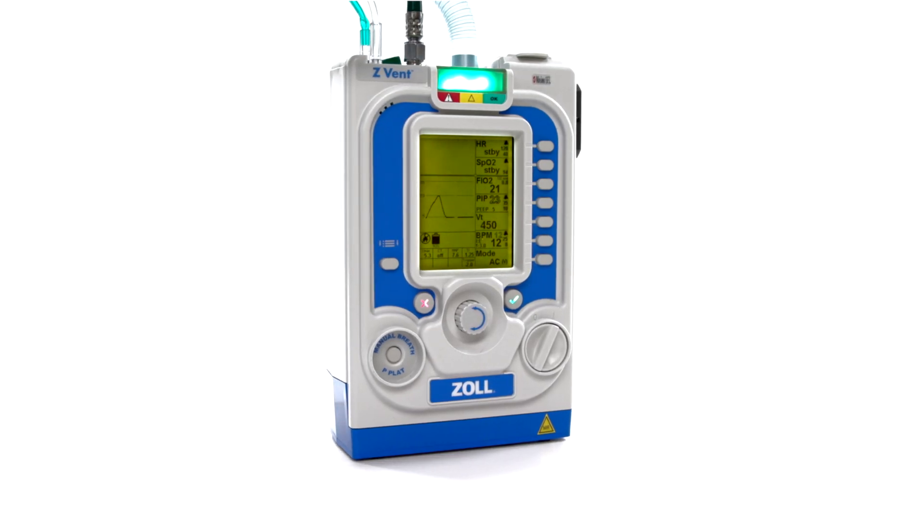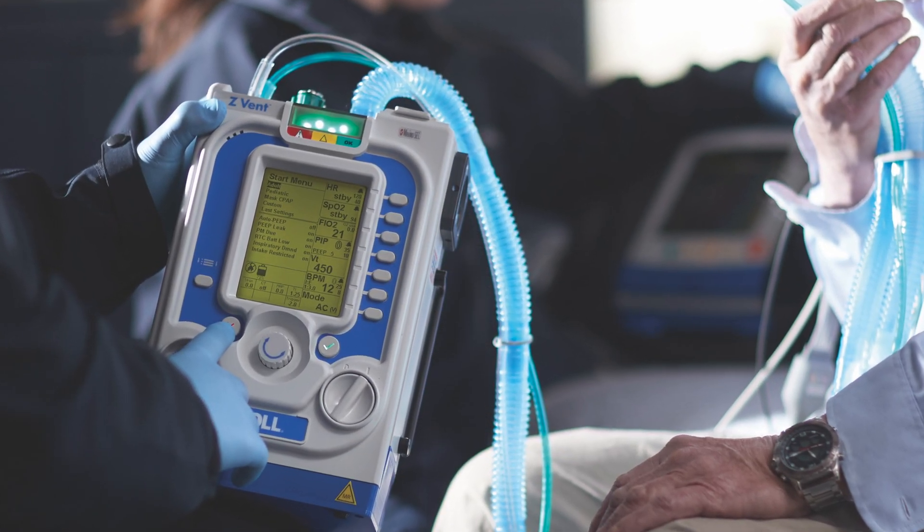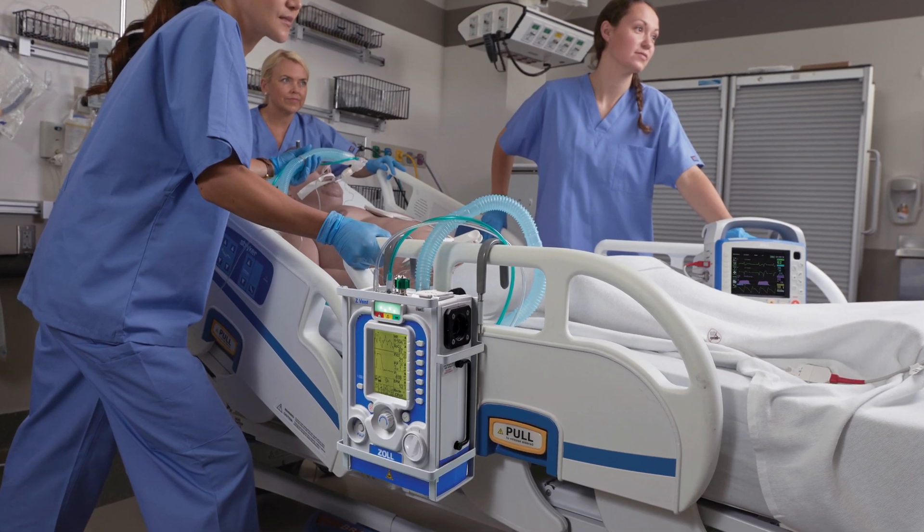The Z-VENT Portable Critical Care Ventilator is a small, lightweight, fully featured ventilator designed to operate in EMS, hospitals, and critical care environments.